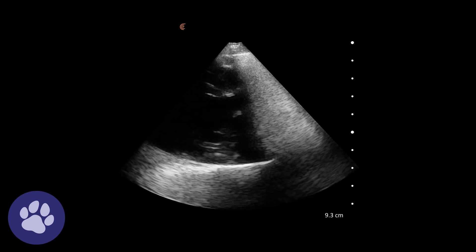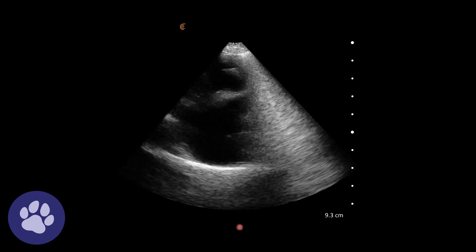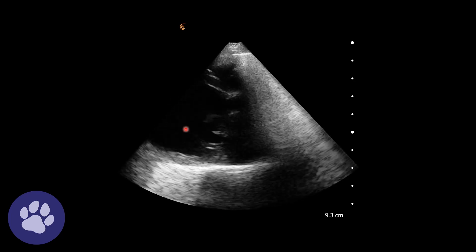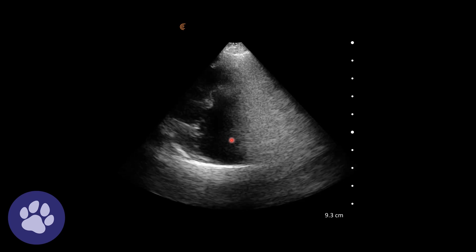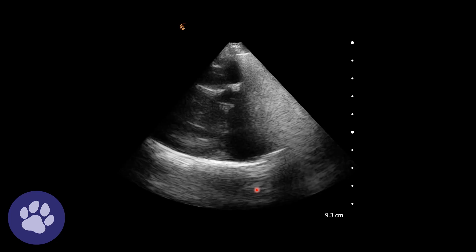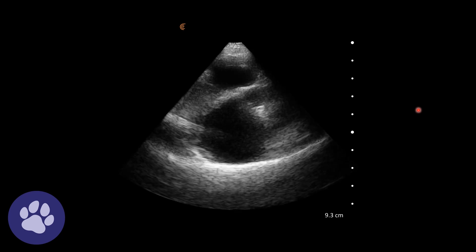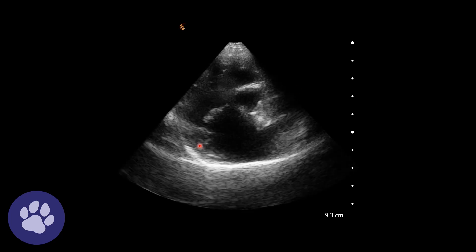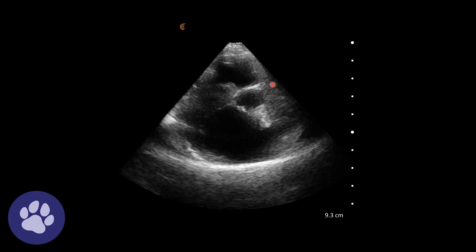Again we have our right parasternal views, but we're now moving the probe to get a short axis view. There's our long axis view — five chamber with the aorta coming in — and then our short axis view with the aorta and the left atrium. In this short axis view at the level of the aorta and left atrium, we've got the aorta here, the left atrium here, and then the right side of the heart wrapping round at the top.